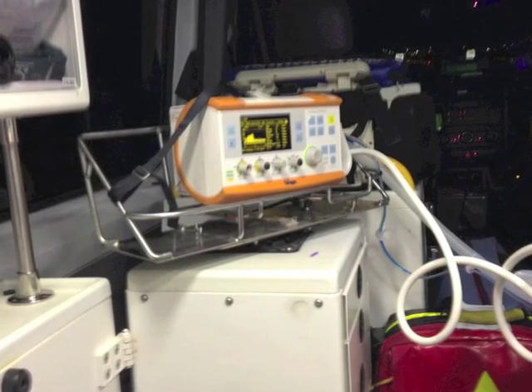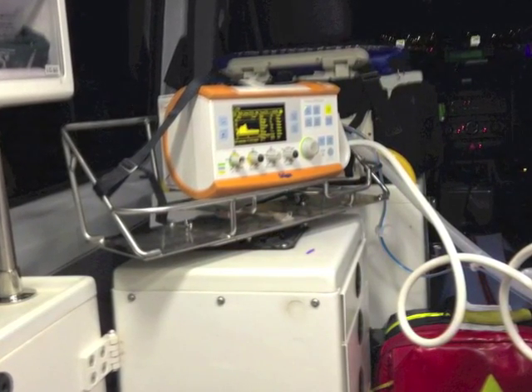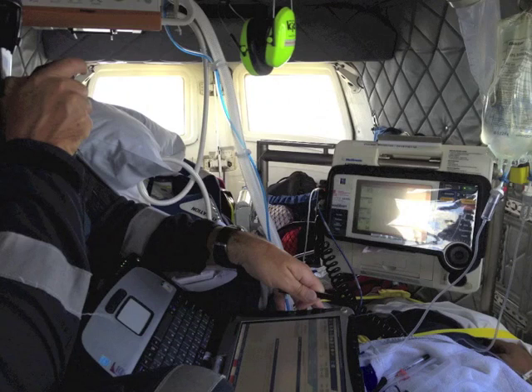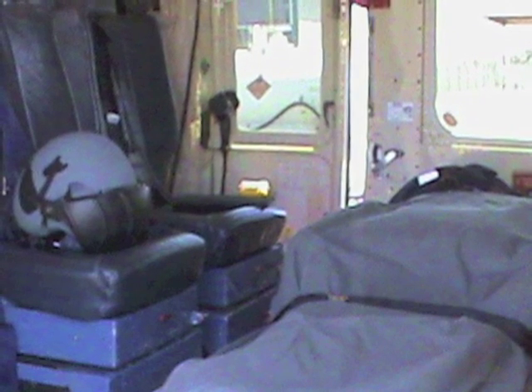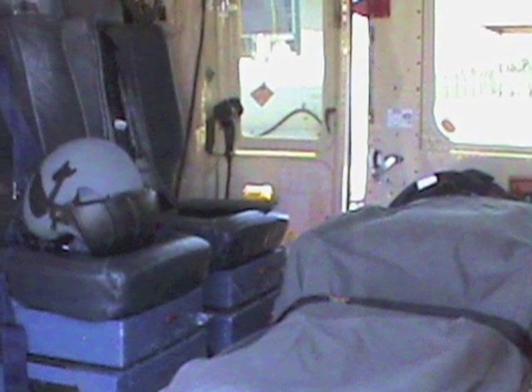All equipment and monitoring must be secured before departure for the safety of both patient and staff. Remember that if transporting via vehicle, access to the patient may be very limited. It is much more noisy and you have less access to resources. Transporting patients by air has specific challenges, which will be dealt with in a separate podcast.